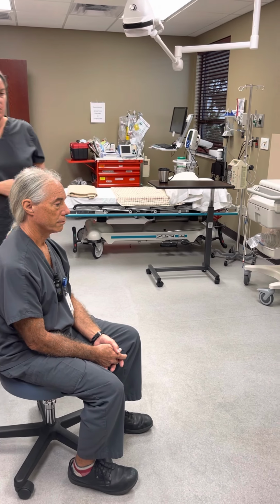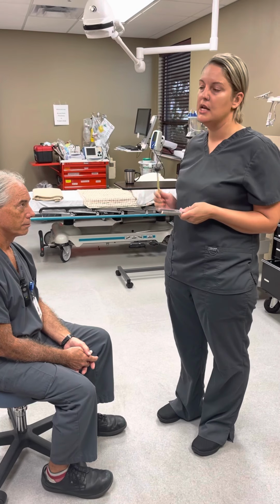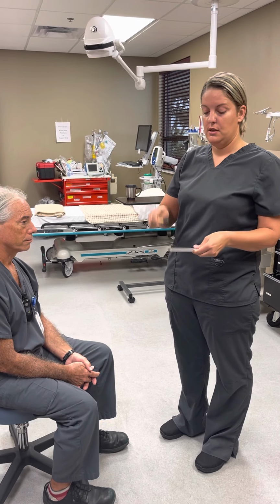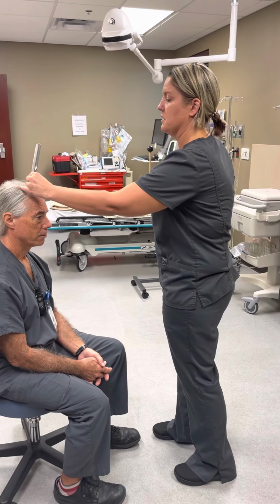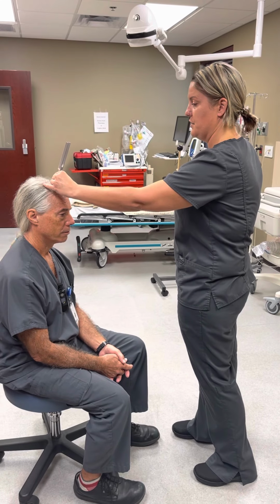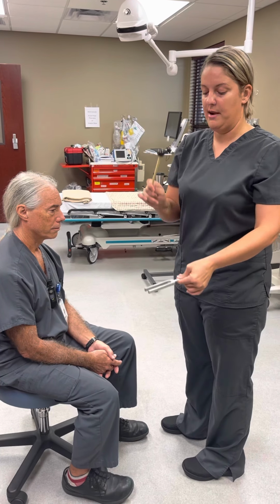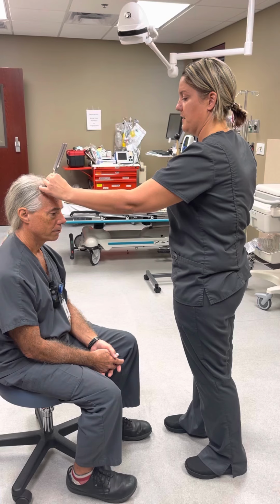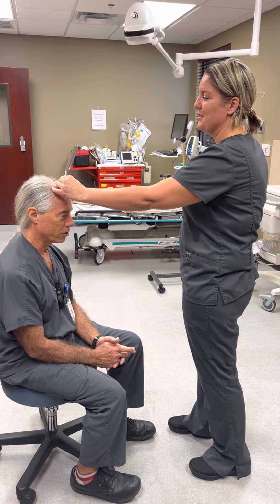So the first thing, we use a tuning fork, and we can do a Weber test and a Rinne test. So the Weber test, you just make it vibrate, put it firmly on the top of their head, and they should hear. Do you hear anything? I'm gonna do it again because it needs to be a good vibration. Do you hear any sound? The air conditioner in the room. Oh, okay. I have a hard time hearing that up there.